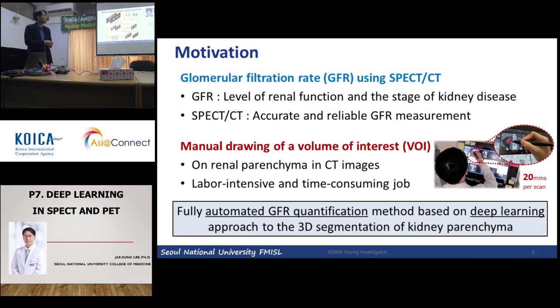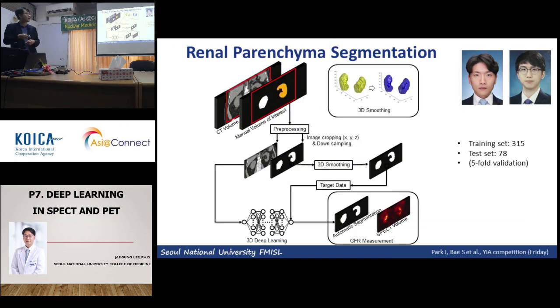This was a collaboration between one of my PhD students and one of our residents, to collect data, draw the volumes of interest and develop the deep learning models.